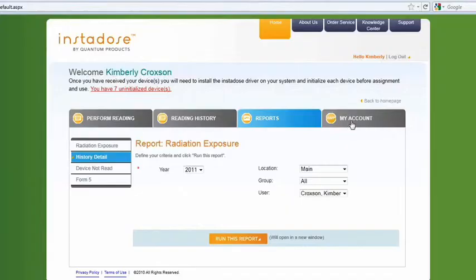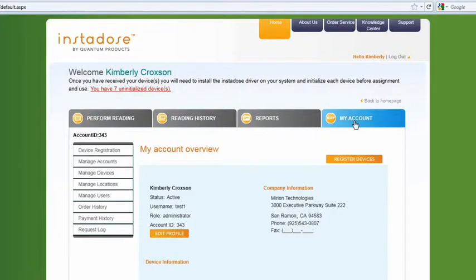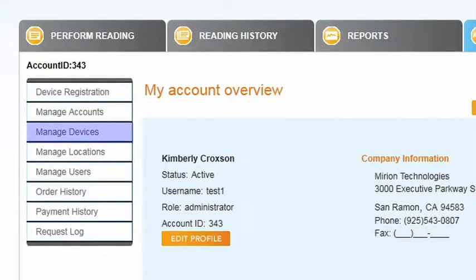From the My Account tab you can manage your account profile, where you can update the pertinent information on your account. Under Devices, you can register and view devices in your account and assign them to wearers.